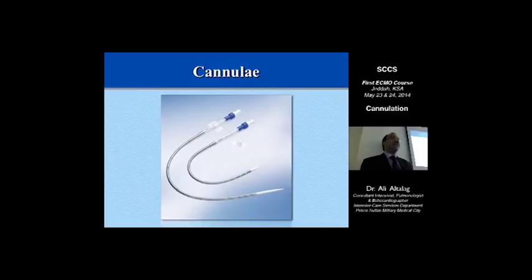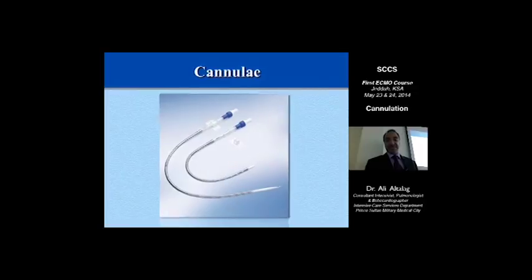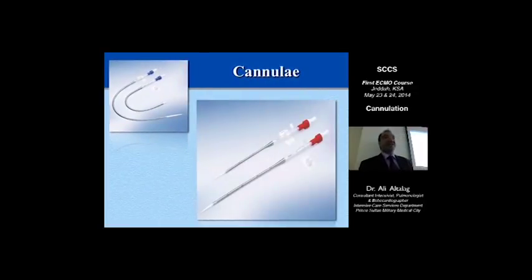And there are different cannulae. This is the cannula we use for venous access or vascular access. So it's blue in color, as you could see. There are multiple sizes and lengths. And we have the arterial cannula or the return cannula, which is marked in red, as you can see. It's a little smaller because now we are not having suction, okay? And you can use it for the IJ or for the femoral.